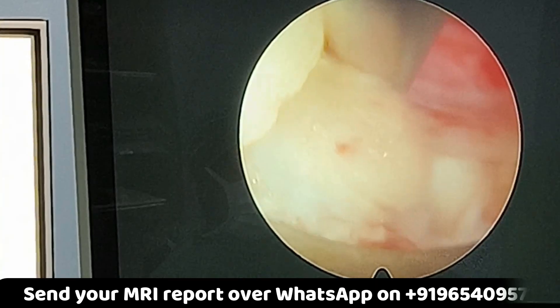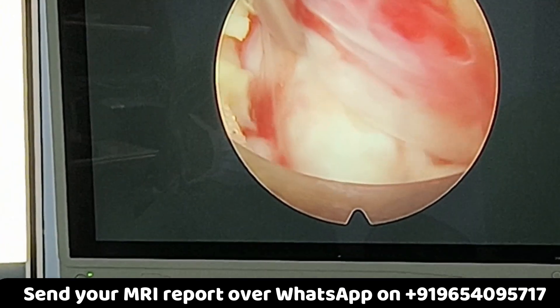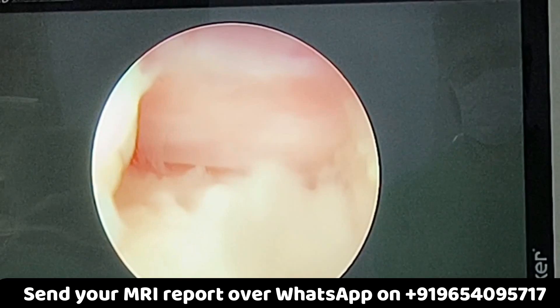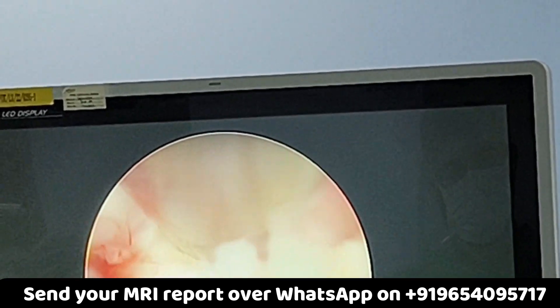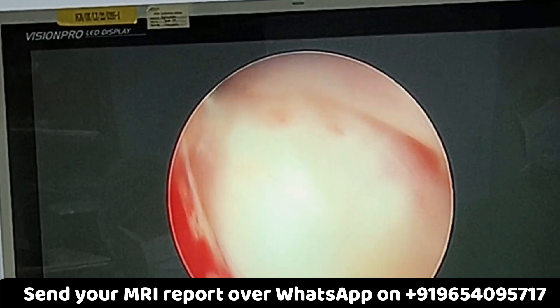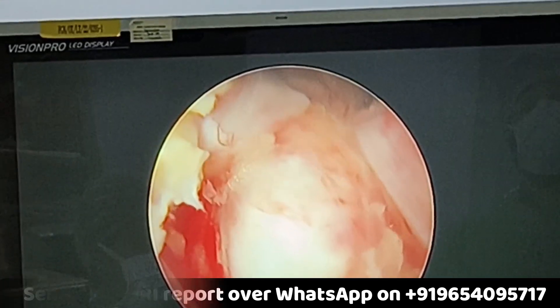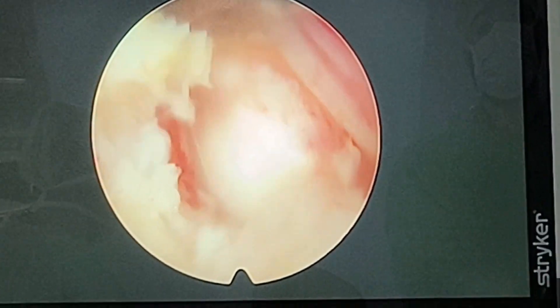After retracting the nerve root you can see the white structure — this is the disc. This is the piece of disc that is causing pressure over the nerve root from behind. We retract the nerve root safely using an instrument and then the disc is fully exposed. This is the part of the disc that we are going to remove.